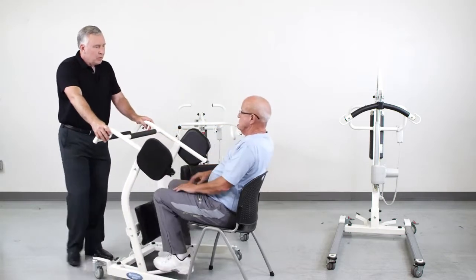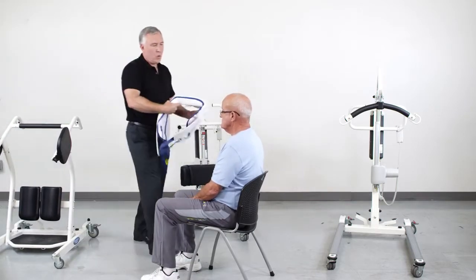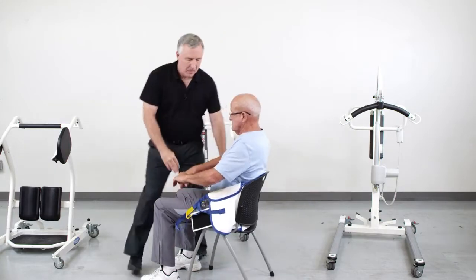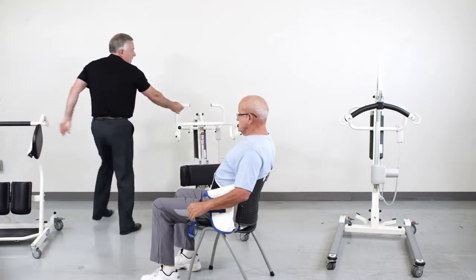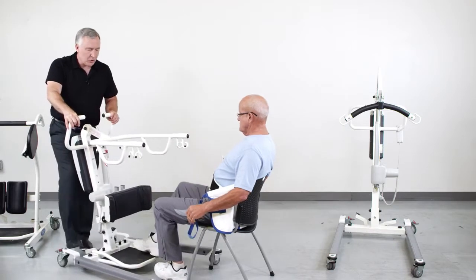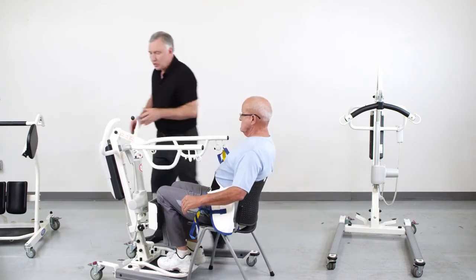So now our patient is not able to pull themselves into a standing position any longer. So we need to use our support vest to help that patient stand. And since we need that additional help to bring that patient into a standing position, we need a motorized device to help pull that patient into a standing position.